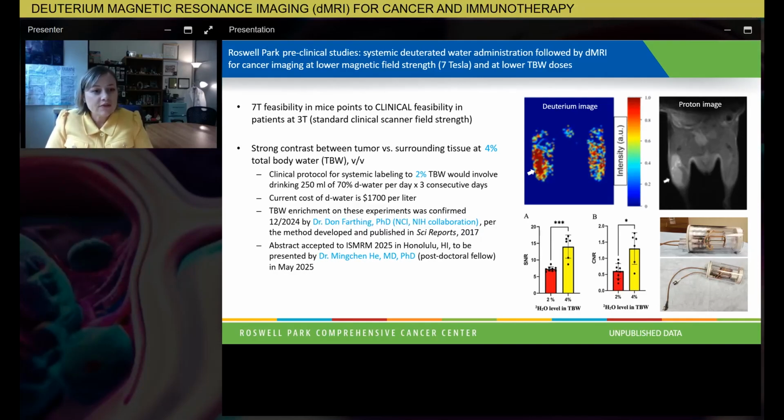Now for deuterium, you have to have a special setup. And that requires multinuclear capability. So I had to set this up both in my animal imaging, but also for clinical imaging, because at this point I was ready to write the clinical trial. So this will be a story now of what it actually takes to put this into practice. So now we're talking about translation between bench to bedside. And I had to set this up in parallel because I continue doing experiments in mice, as I will describe on subsequent slides. And I'm also ready to translate some portion of this research into clinical practice now. So when I came to Roswell, we had a different intensity of a magnet.